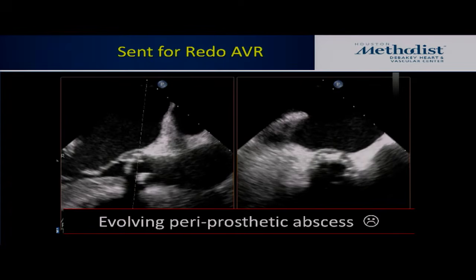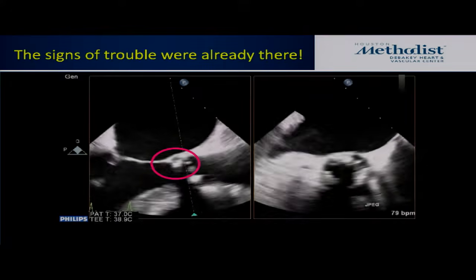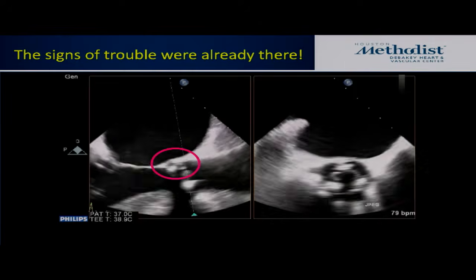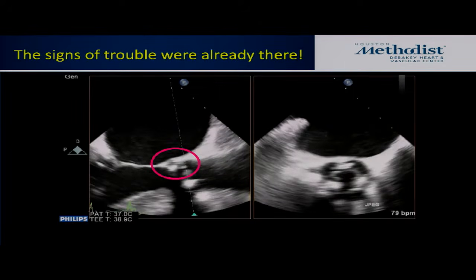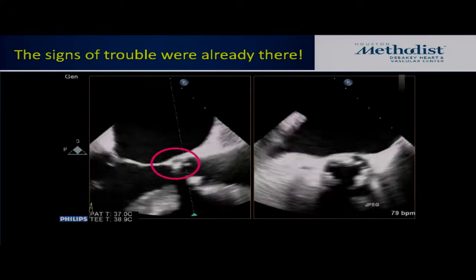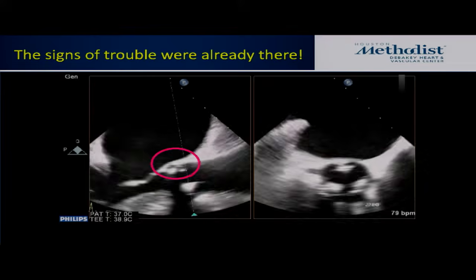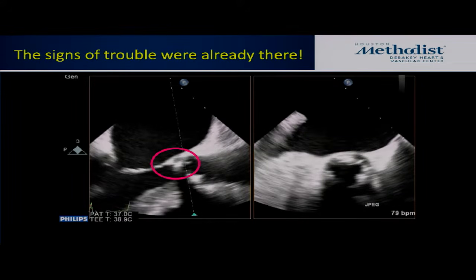And in fact, if you had looked back in detail at the very first view, it was there. So this is Faisal, the case I mentioned to you. It was there at the very beginning. There was a central lucency. So the abscess was present. It was a waste of time sending this patient for 2 months of antibiotics because they needed surgery. Okay.